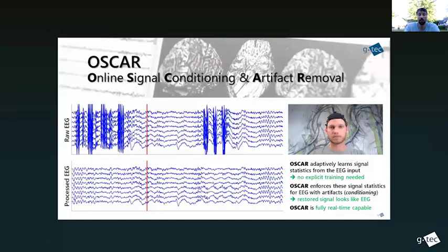And one interesting part when it comes to movement, also in animals, particularly the artifact, is the OSCAR software, so the artifact removal that we provide. So it's particularly interesting also to work with animals. So this is also something that we are particularly working on, right?